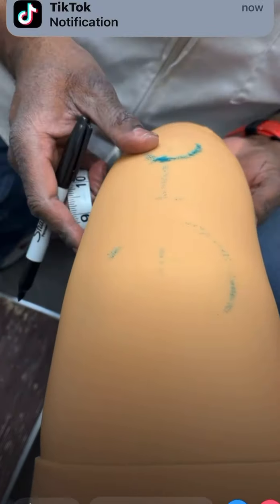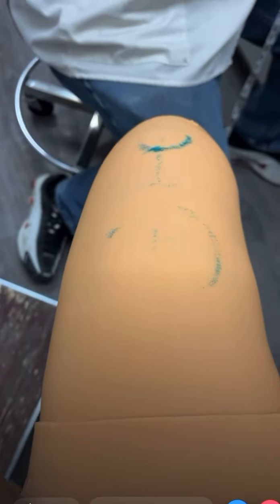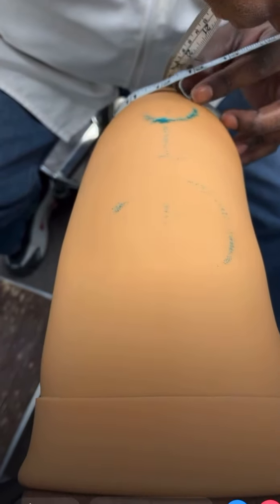Getting fitted for some new sockets — you know how I like to do it. What design should I put on these? I had the Versace, I had the Money Den. What should I put on these? Marvel? What should I do, Shakitha? You know how I like doing. I got to get ready for the summer, for that grand opening, so I can wear some shorts. Give me an idea of what design should I put on them.